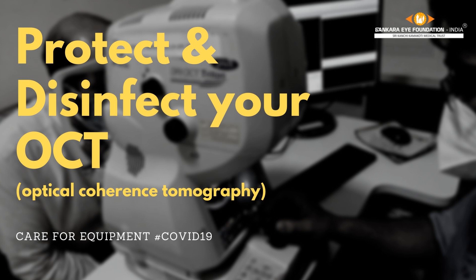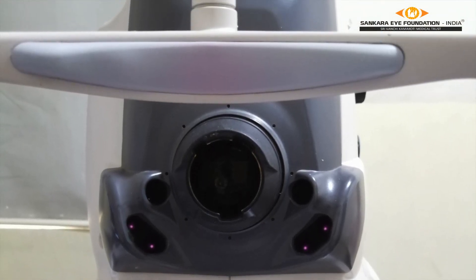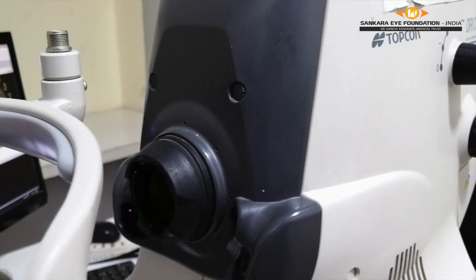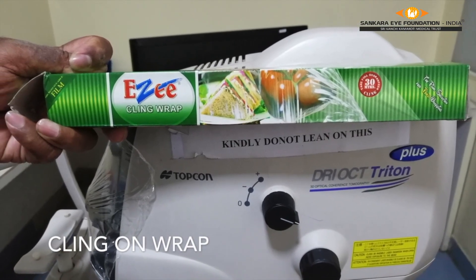Presenting a short video to demonstrate how we can reduce the risk of contamination during an OCT investigation. The only material required is a plastic Cling Wrap.